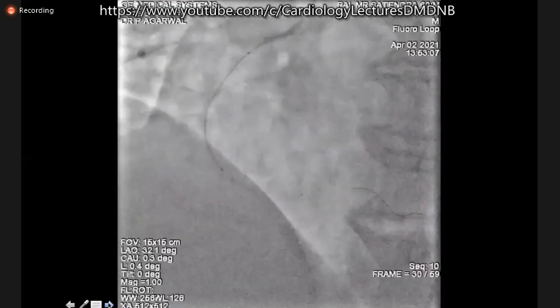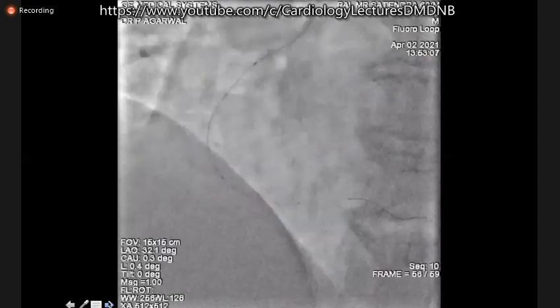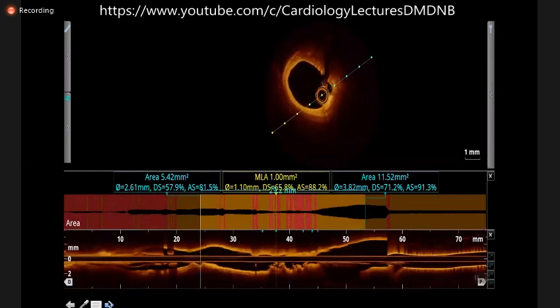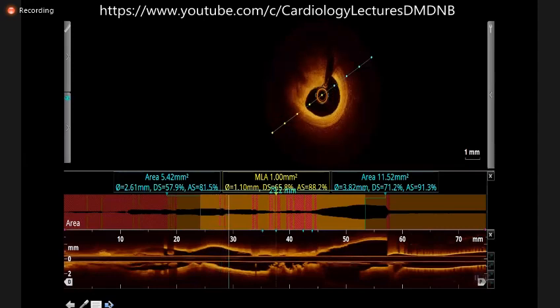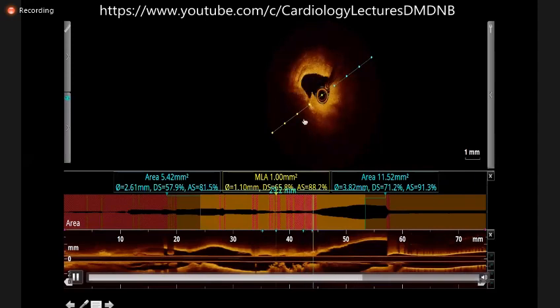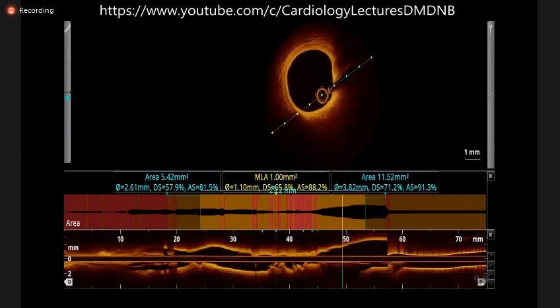Now it's an OCT picture. You can see good fibrotic areas all around. And just see, this appears to be some white thrombus sitting inside the lesion. There are small chunks of calcium here and there, but nothing major. Mainly it's fibrosis in the artery.